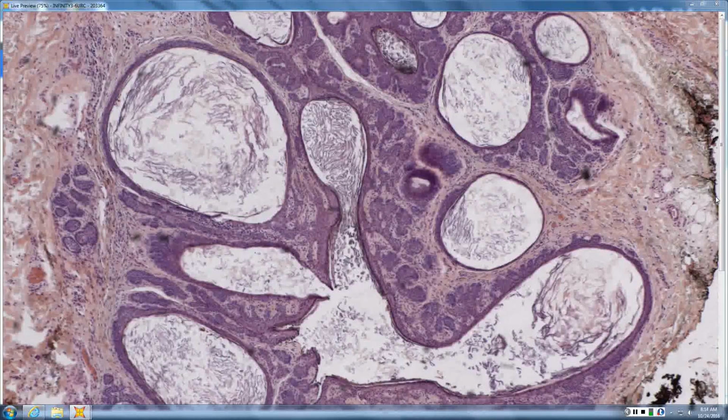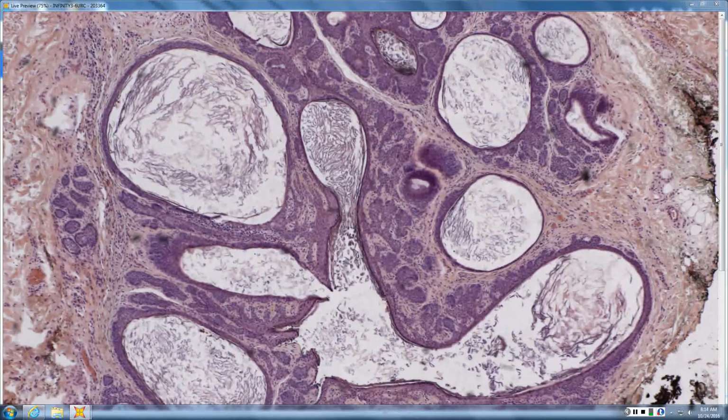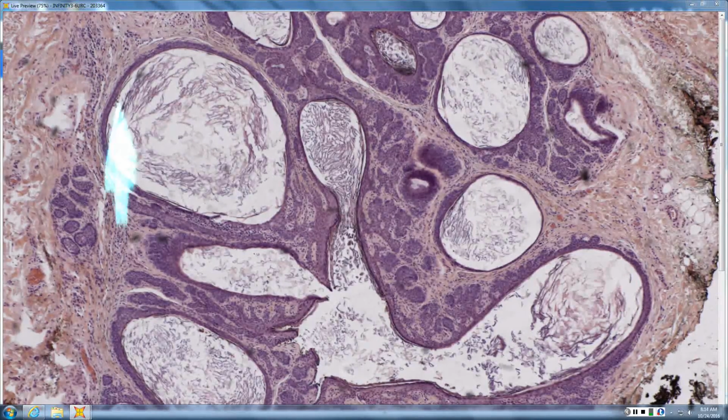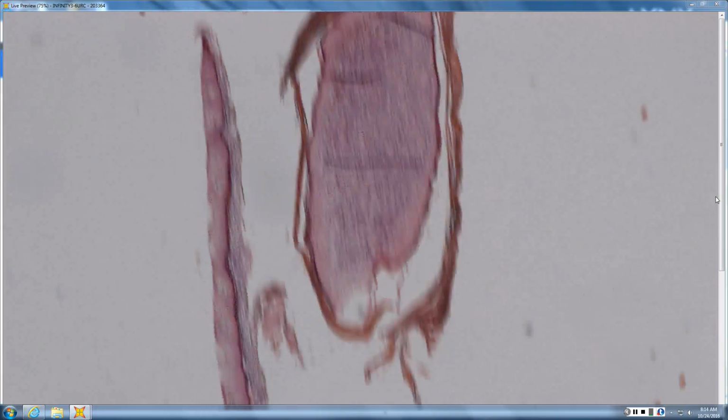This one's probably more like basaloid follicular hamartoma, because it looks sort of trichoadenoma-like here. Does not belong in that chapter. Okay. That one's probably too small, so let's skip that one and go to this one.